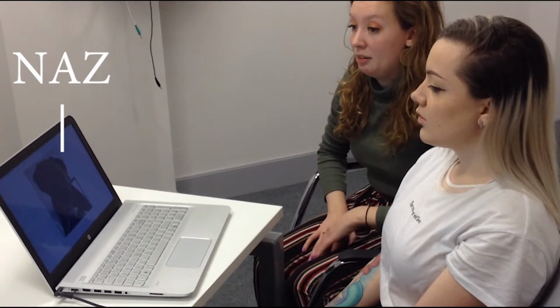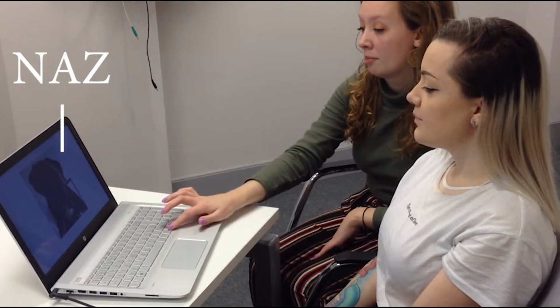So this image is the oddball of the experiment. It is neither relevant or irrelevant and may spike a brainwave on the polygraph due to the image being odd to the participant. Oh, okay.